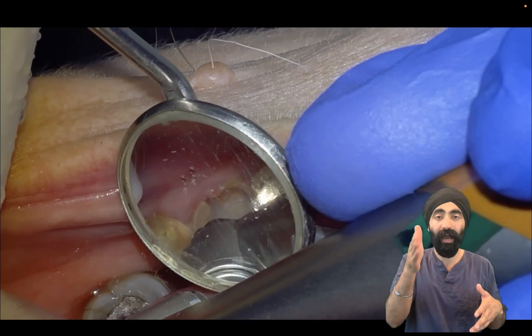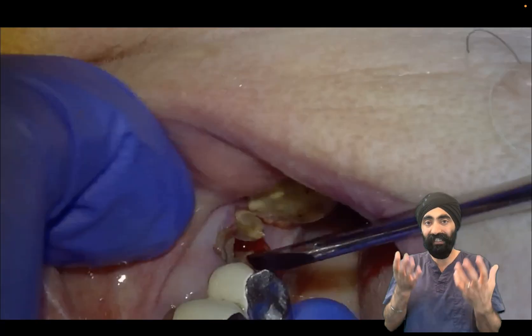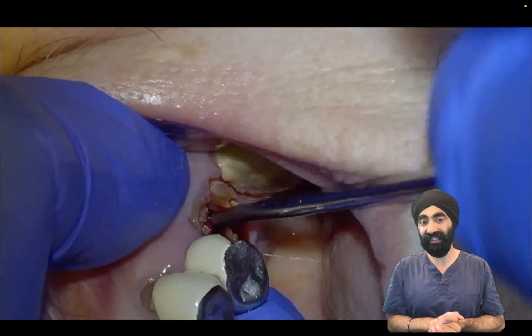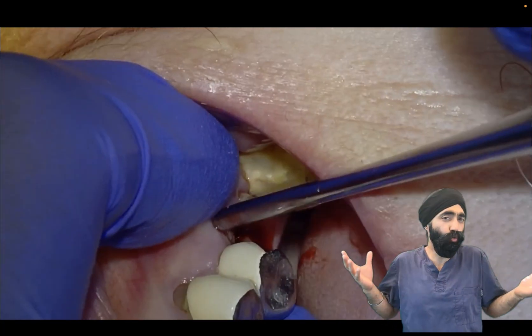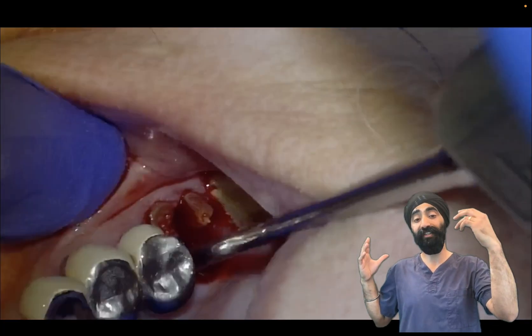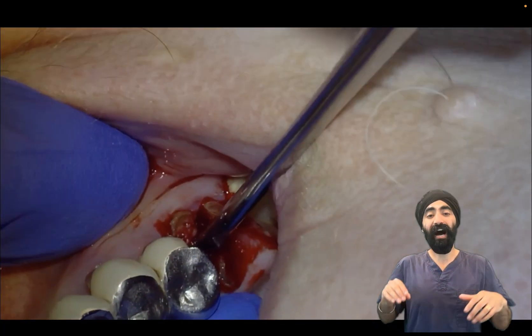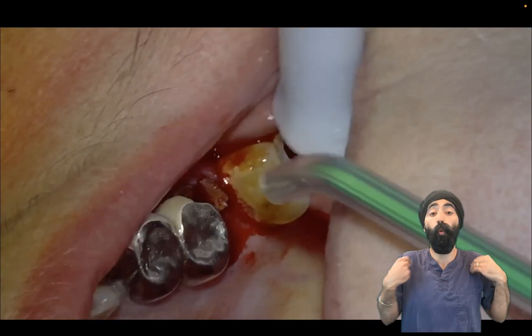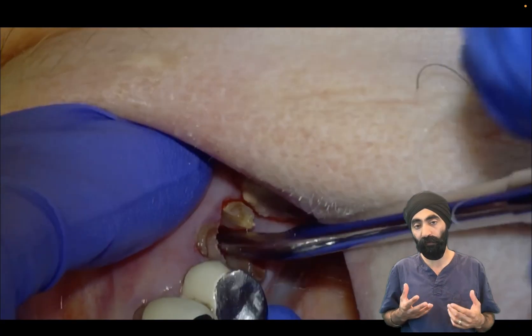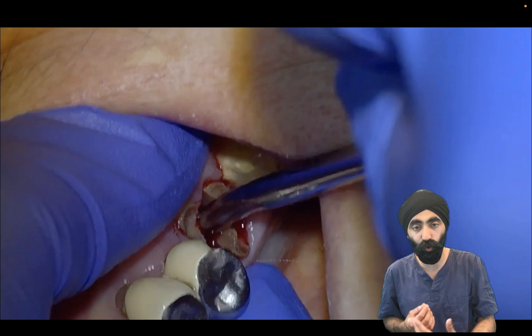I'm getting right to the bone — I want to see some bleeding. Bleeding is a good thing to see when you are sectioning. I'm now using some luxators again very carefully. Which root do you remove first? I know some people have a preference — Chris Waithe likes to go for the disto buccal root first always. I just like to see whichever root wants to come out first. In this case it was actually the disto buccal root — it was showing me the most potential, the most mobility.